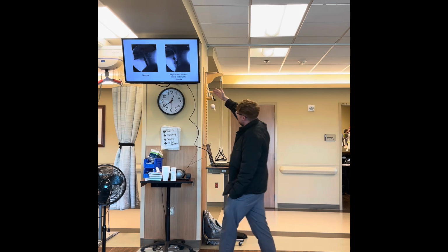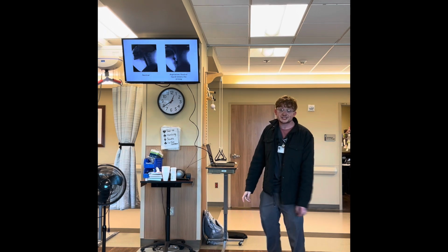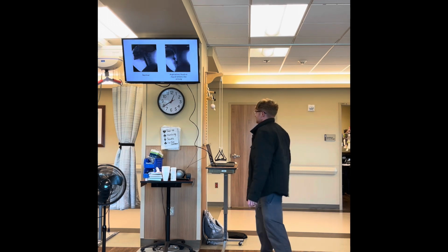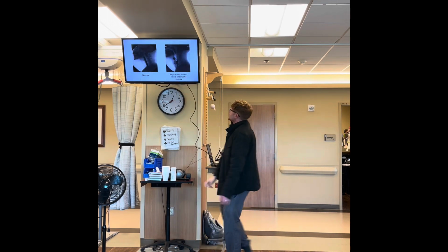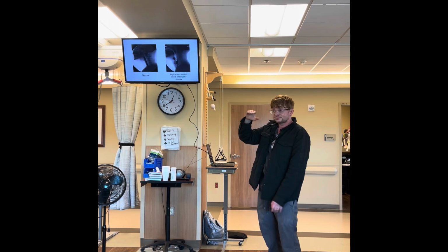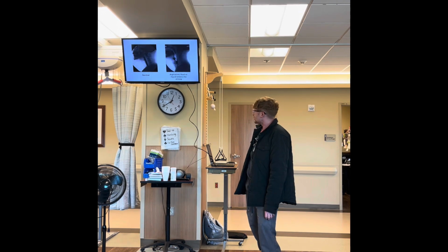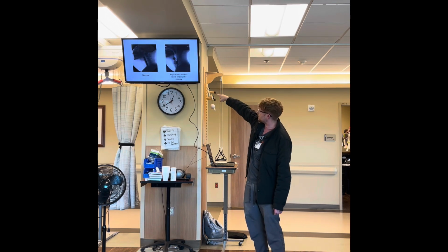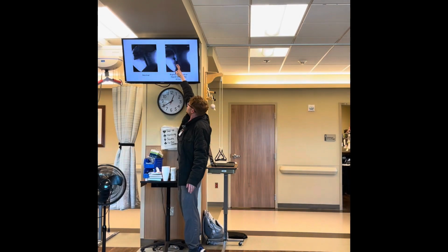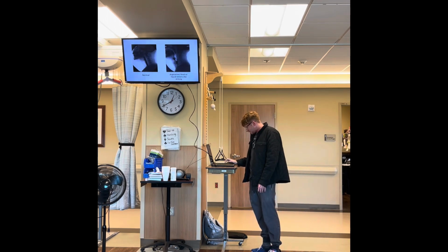It's found its way. Not only is it going down the airway, but we're also looking at the amount of residue that's left behind when they took a drink. So the pocket behind the tongue, you'll see that dark spot right up there. That's called the vallecula. Fancy way of saying the pocket behind your tongue. So there's obviously some trouble they're having pulling back the tongue to get rid of all of the drink there. And it's pooling there as well as in the piriform sinuses, which are right in here. Those are two images there.